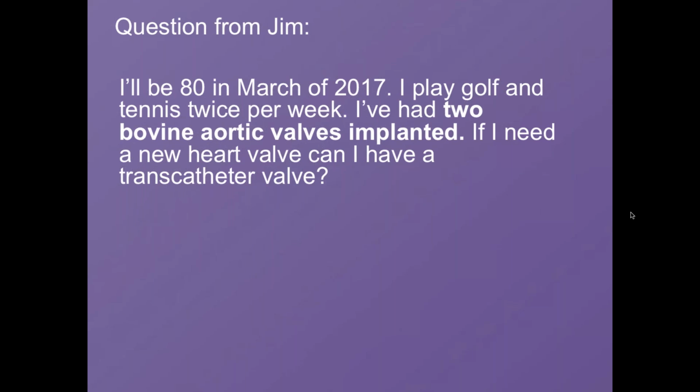Correct, Adam. So I think the most striking feature of the TAVR procedure is the very short recovery time. Patients who have a TAVR procedure, in this case an aortic valve-in-valve, can expect to have this procedure with no general anesthesia. Average length of stay in the hospital, about 3 days. The majority of these patients go directly home, do not need to go to rehab, and would likely, for this patient, be able to start playing golf again in about 4 weeks. This is compared to open heart surgery, where we'd expect maybe about 5 days in the hospital and about 6 weeks of recovery time for the sternum to reheal.